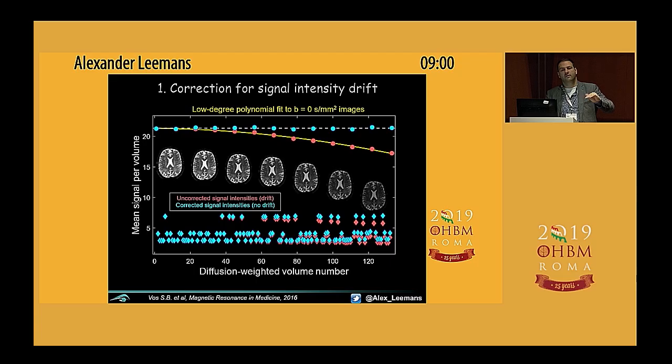If you go higher, then obviously, if you remember, higher B values means lower signal. You might be dropping towards the noise floor, so what you end up with is just noise, and then you don't see the drift anymore, right? But up to a B value of even 2000, it's fine.